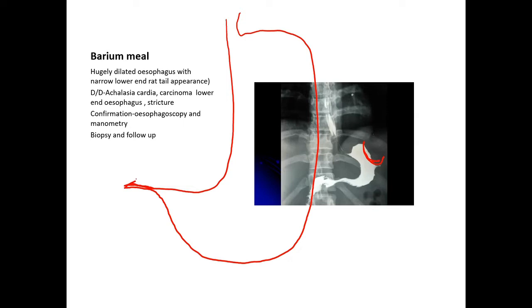Roomy, absence of drainage of this contrast into the duodenum. Now you might see some shadows of your food residues.